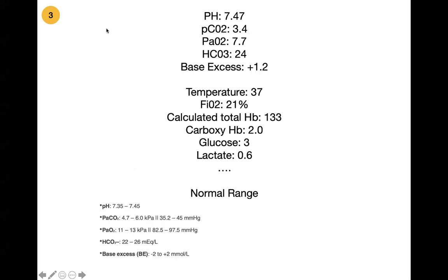Yeah, so great job. What we've got going on here is a respiratory alkalosis. We're looking at our pH, and we're immediately comfortable with our range now. We know 7.35 to 7.45. We're immediately able to say we're looking at alkalosis. Then we go to our PCO2, which is low. And we're looking at our PO2. Do we feel happy with this person's respiratory status, or is something a bit unusual? We're seeing our PaO2, so something is going on.